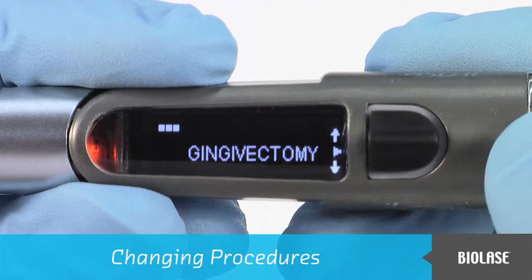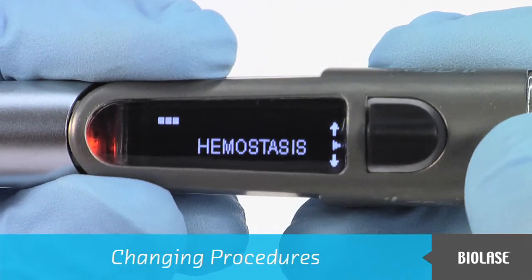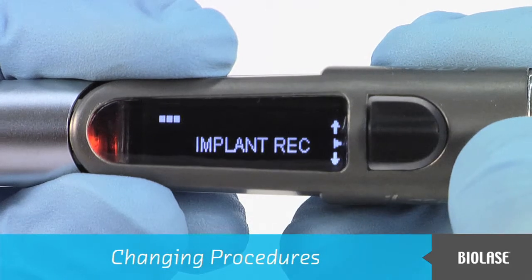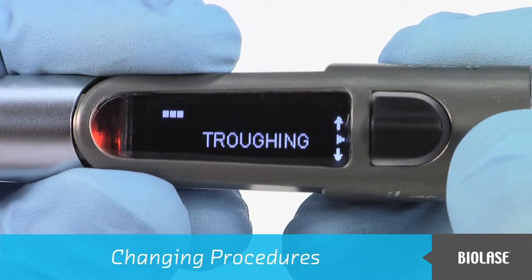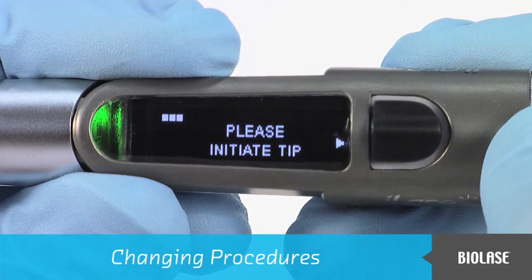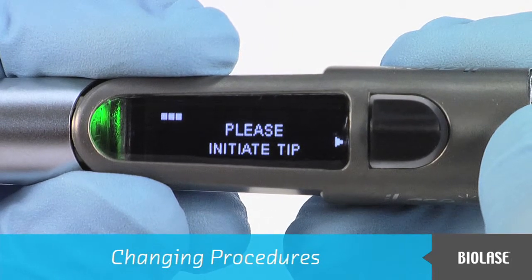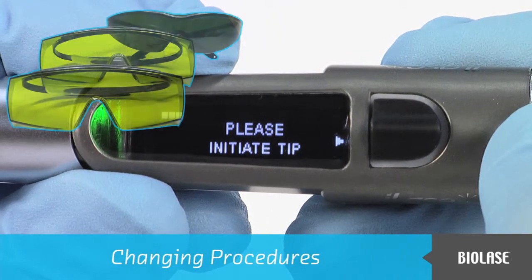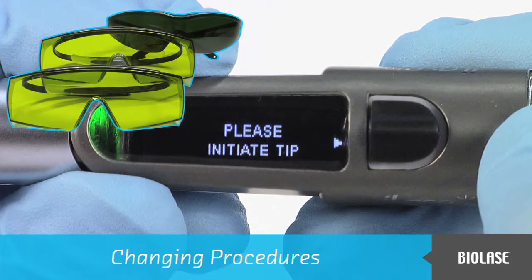Then press the navigation button in. The Select Procedure screen appears, and pushing the navigation button up or down will present the different procedures available. Pressing the navigation button in will select the new procedure and also place the system into Ready mode, as indicated by the green LED and the red aiming beam. Please ensure that everyone in the room is wearing the appropriate eye protection.